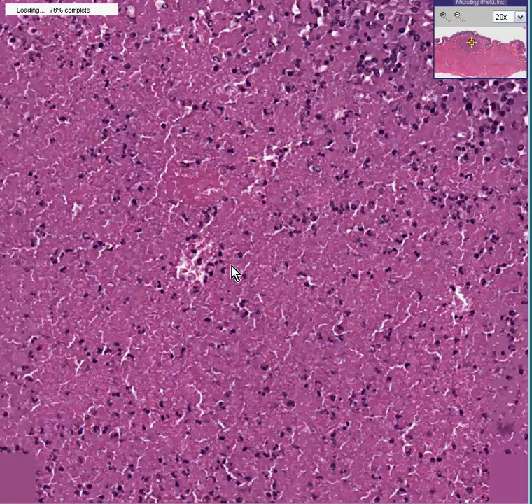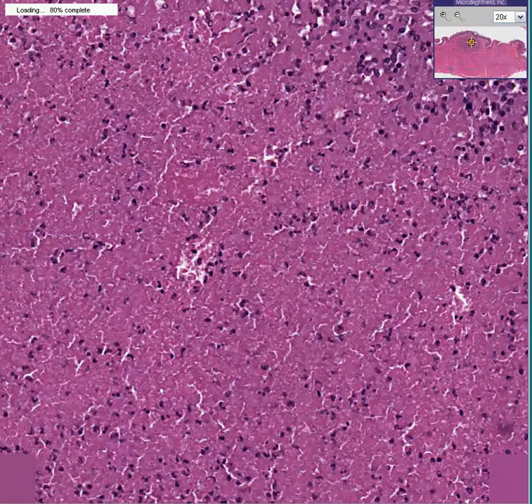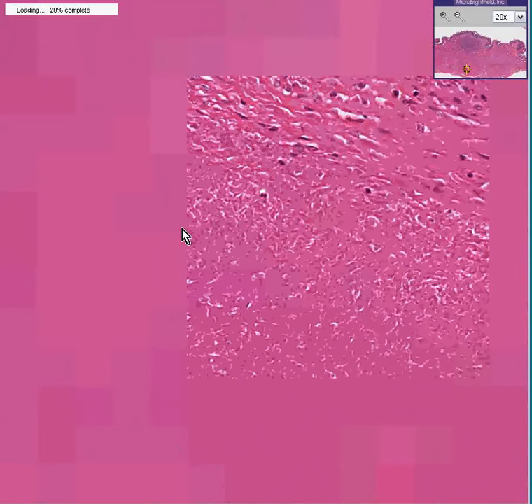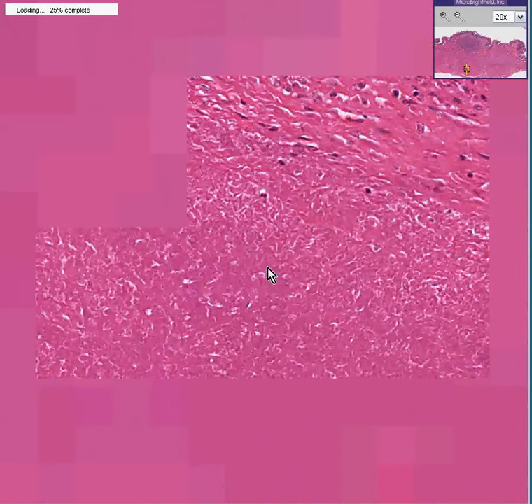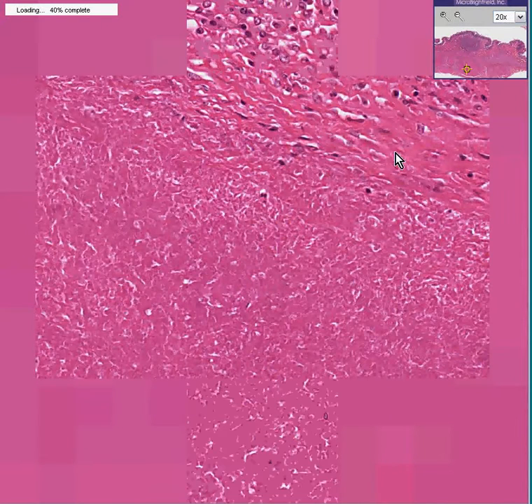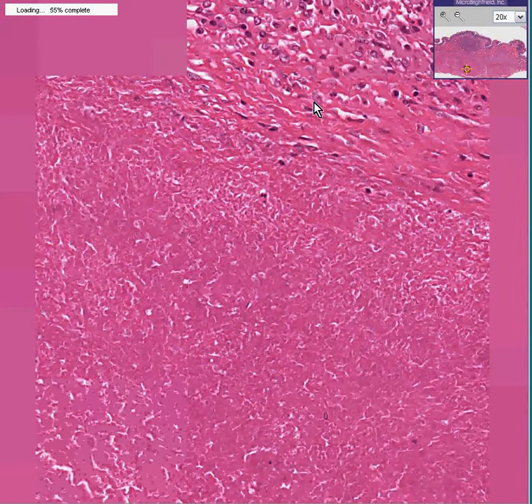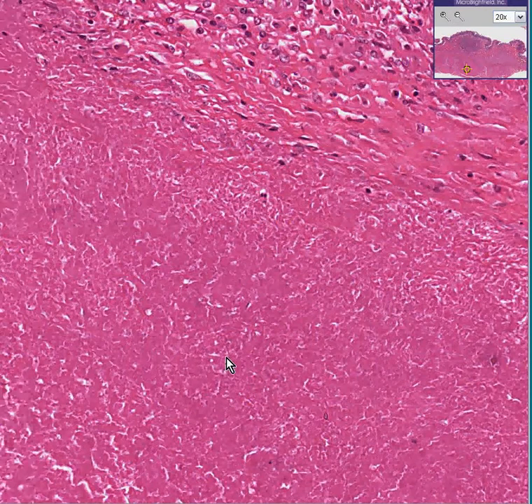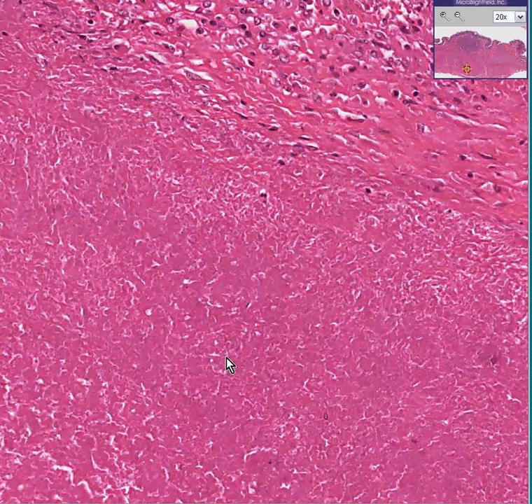Here is the middle of one of those big granulomas in the serosa. Whereas out here you might see some fibroblasts, there is no cellular detail in the center — this is necrotic debris. Necrotizing granulomas in the stomach, as anywhere, are TB until proven otherwise.